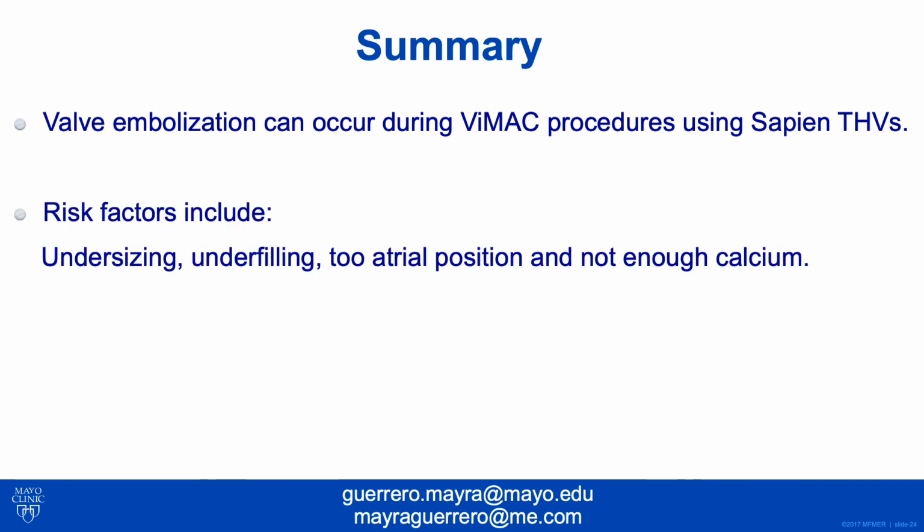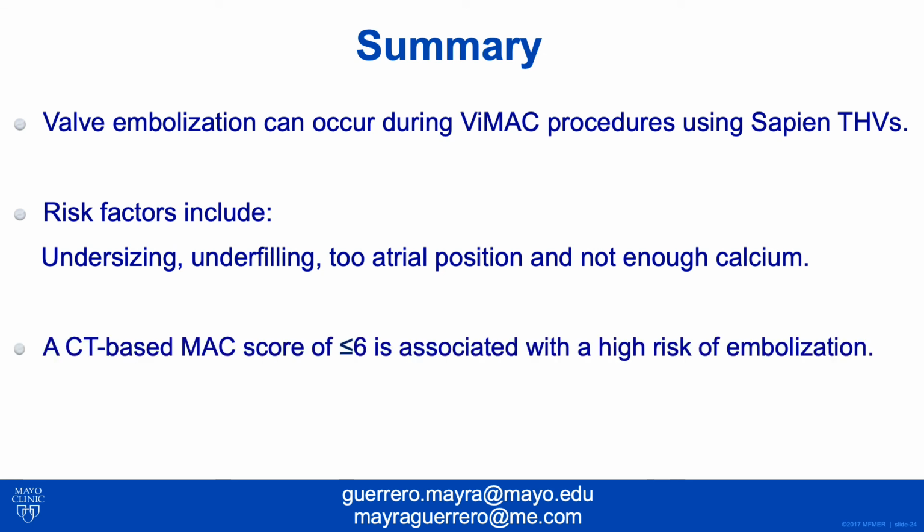Risk factors include undersizing, underfilling, a too atrial position, and not enough calcium. A CT-based MAC score of 6 or less is associated with a high risk of embolization.